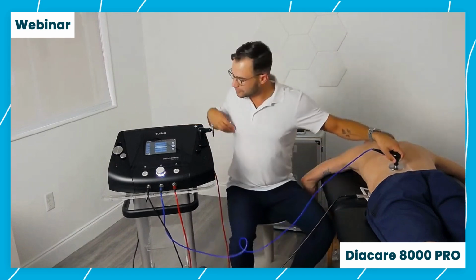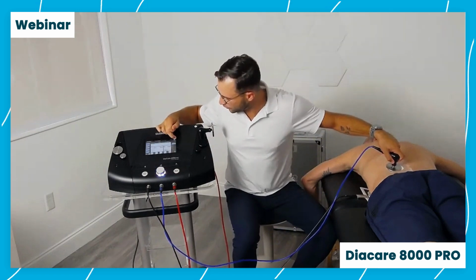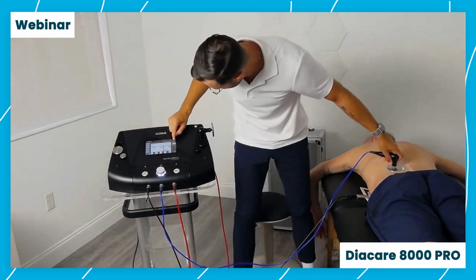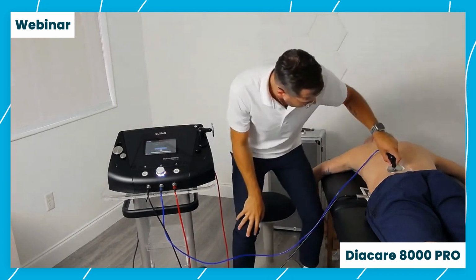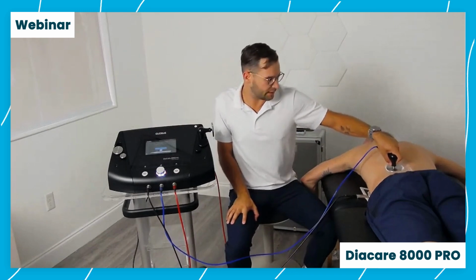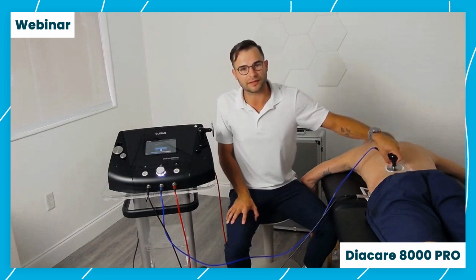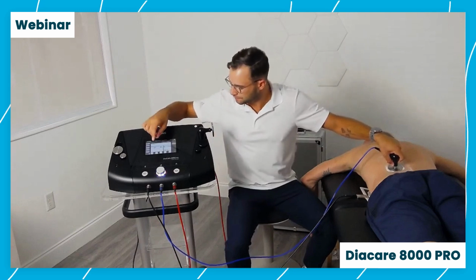We're going to place it on our patient. Go ahead, hit OK here. And once again, we're going to calibrate the machine. Great. So there's a loading screen. It's going to tell you just to hold the head of the electrode exactly where you're going to be treating, so it can start reading that impedance and make sure that the patient is nice and safe and prevent any kinds of zips.